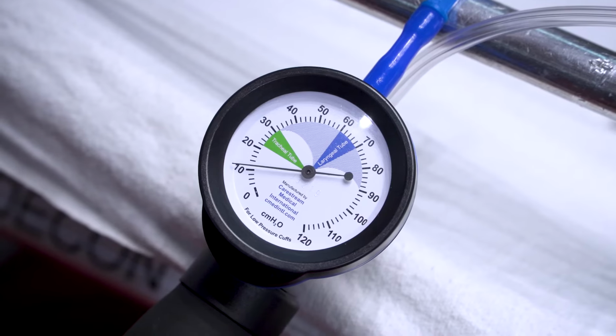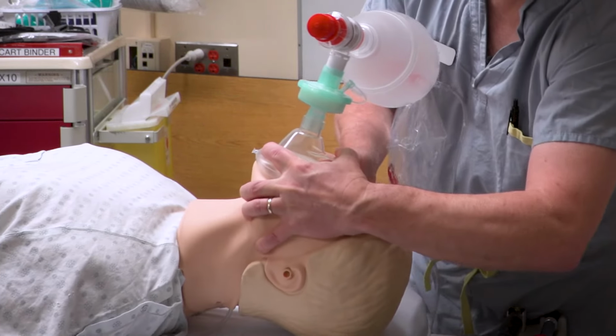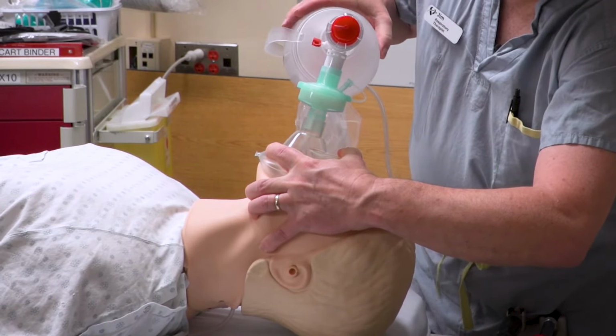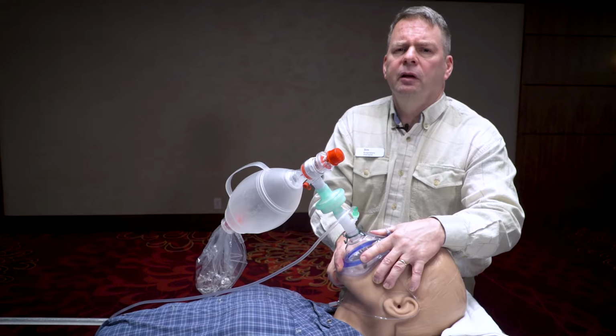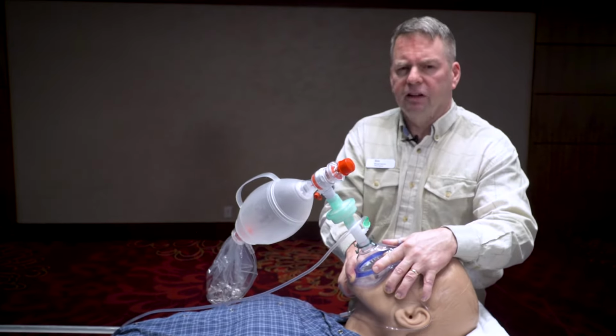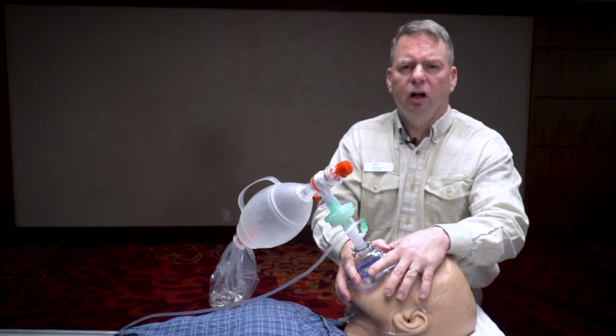But the pressures are kept low. When you're bagging, a lot of times the pressures are so high that the air will often go into the stomach and cause more problems. Using this type of system allows you to use very low pressures but very high flow rates, and it's a very effective way to oxygenate people that you wouldn't otherwise be able to oxygenate.